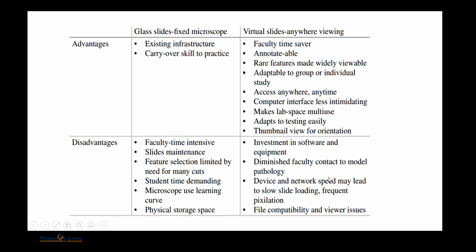The disadvantage of virtual slides is we have to invest a lot in software and equipment. There is diminished faculty contact. We have to motivate our faculty, our technicians, and everyone to move towards digital pathology for acceptance. Next we have file compatibility and viewership issues, and device and network speed.